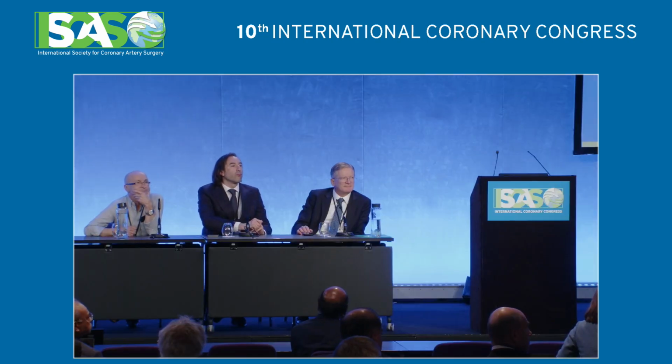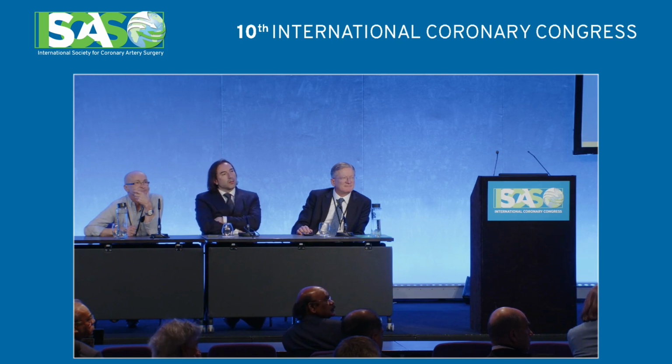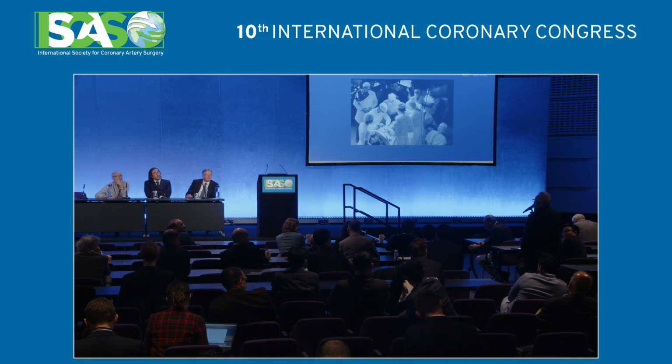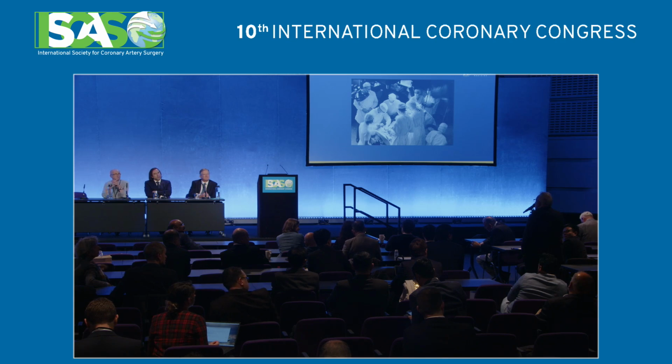Please, I would like to remind the audience of this presentation by the Chinese surgeon last year in New York, the guy working in Wuhan who does 3,000 bypass surgeries per year. He presented 1,000 cases with FFR before surgery. And he came to a conclusion which was very interesting: that for Lima and saphenous vein graft, if you go below 0.8 for an FFR, it's fine in terms of patency.